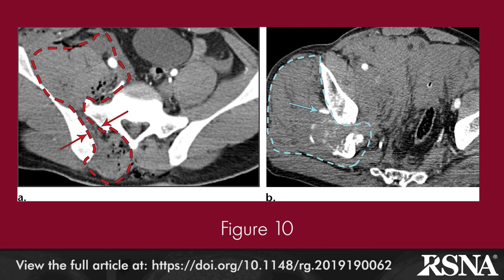The article then addresses the association between pelvic fracture patterns and location of arterial bleeding. For example, posterior pelvic ring fractures are associated with injury to the gluteal, iliolumbar, and sacral arteries, as seen in Figure 10. Figure 10a shows combination injuries of the iliolumbar and lateral sacral arteries with hematomas in the right iliopsoas and erector spinae muscles with sacroiliac joint disruption. Figure 10b shows combination injuries of the superior and inferior gluteal arteries, a pelvic gluteal intramuscular hematoma with active contrast extravasation, and an LC fracture.